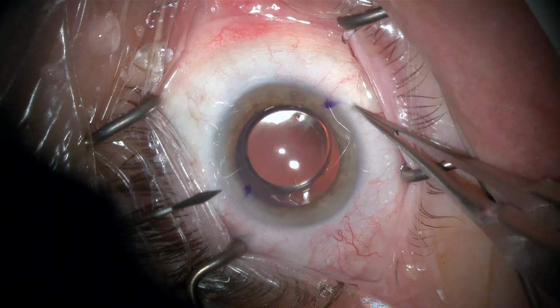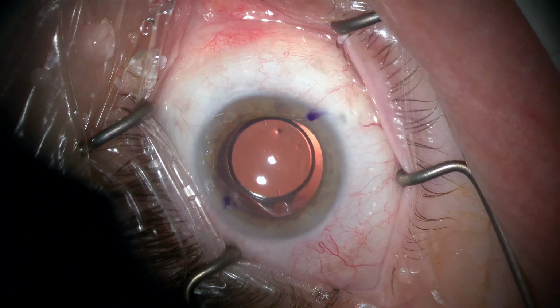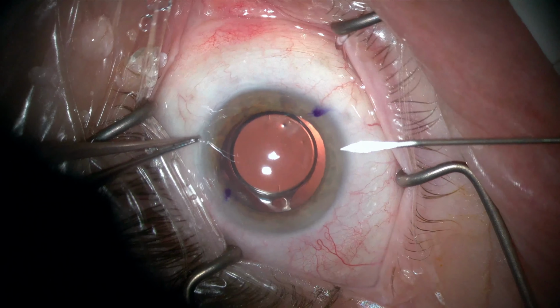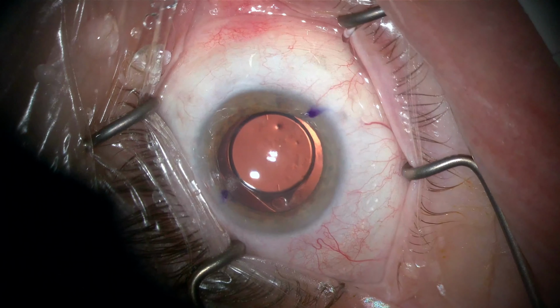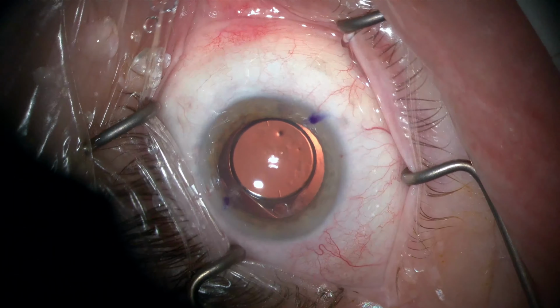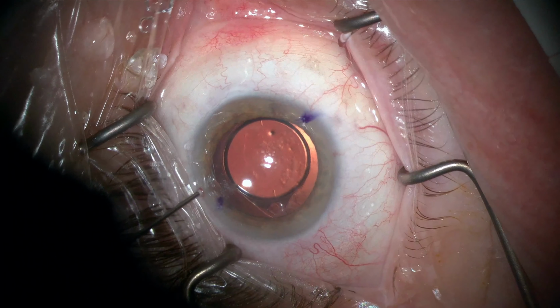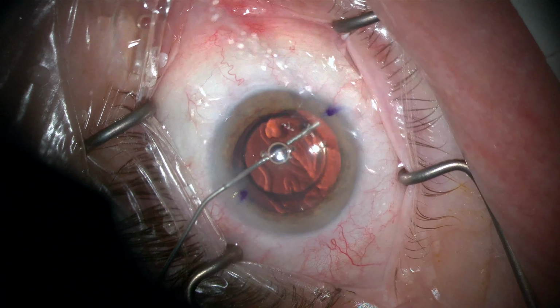Next, I'm making two paracenteses to give me access on either side for the rotation. And then a dispersive viscoelastic is used to fill the anterior chamber and coat the corneal endothelium.